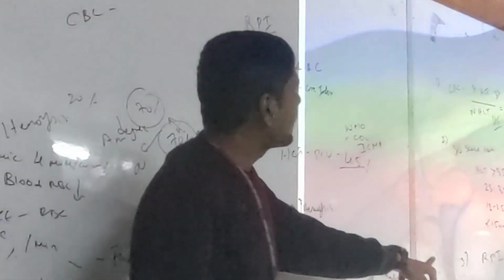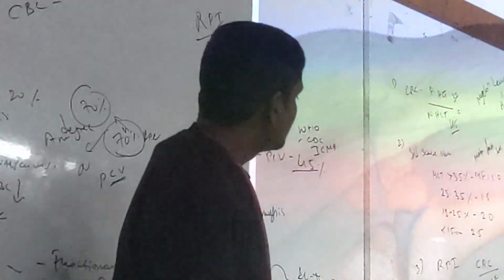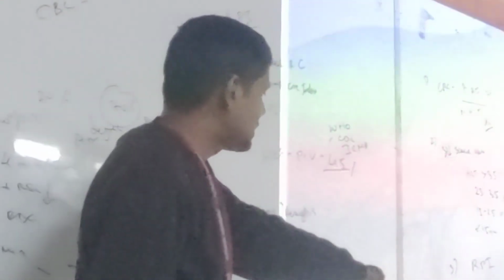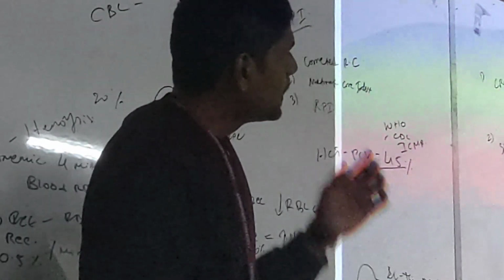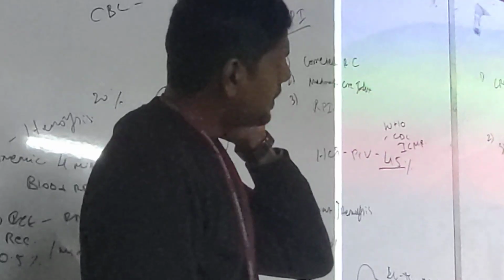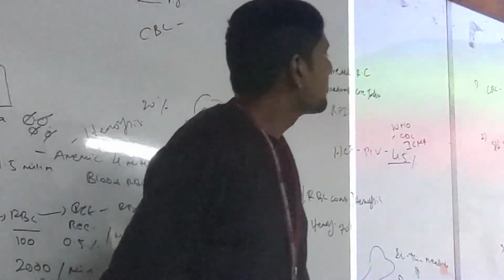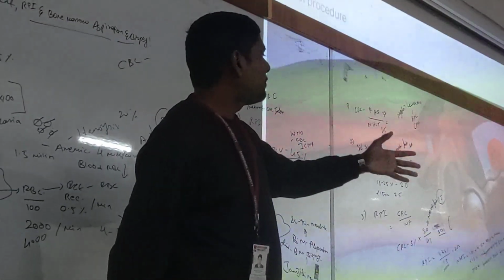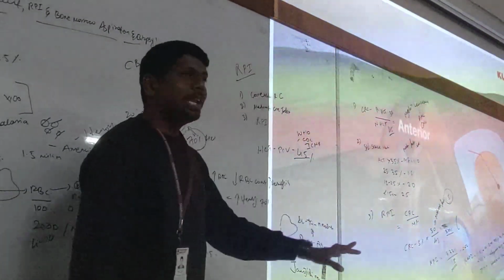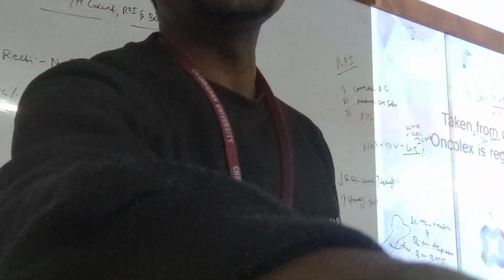They are using specialized needles here. So go with the iliac crest. So yeah, there is the iliac crest. You can collect from the iliac crest, from the tibia or from the sternum. Yeah, they are trying to say that this needle has some flexible properties. Anyway, this is an animation. I don't like animations. I will show you an actual video.